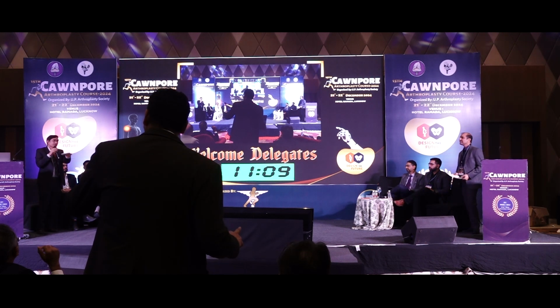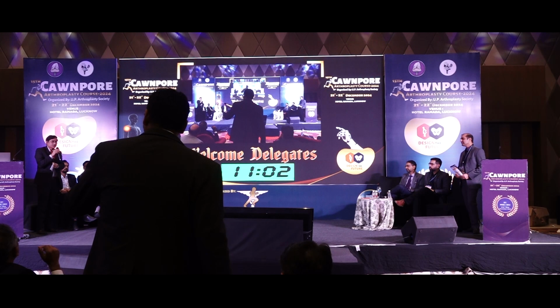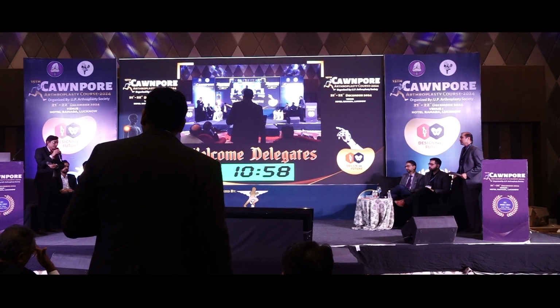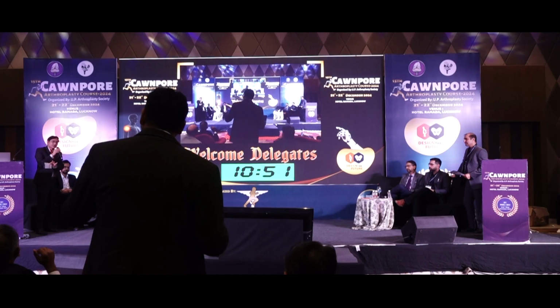I think what he has mentioned is the practical thing. Suppose there's an image, the image intensifier should always be handy. So it should always be in the theater, and if required, it should be used. Another thing is we use it in the posterior approach, so it's very easy to see. It's not very difficult to see with the image.